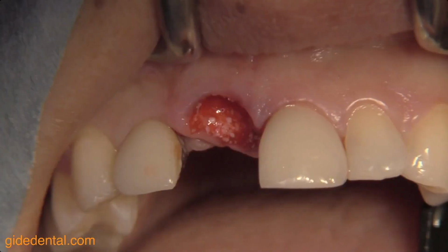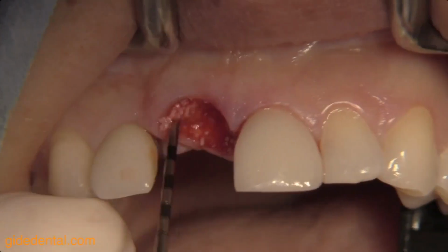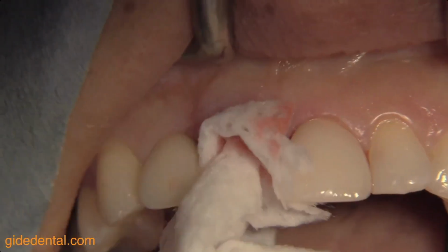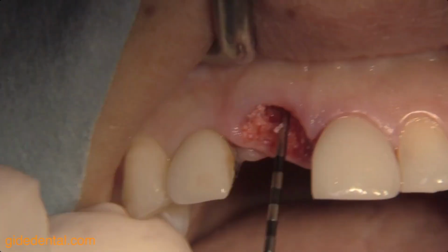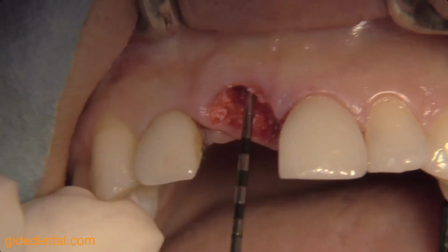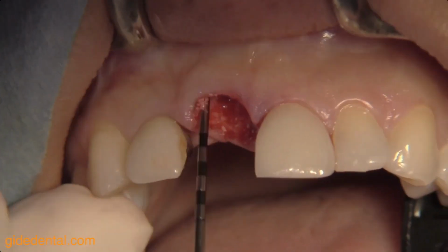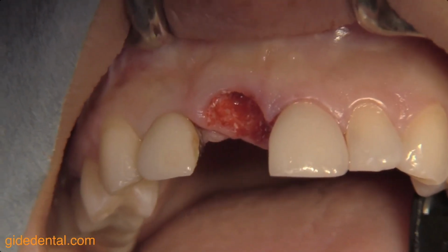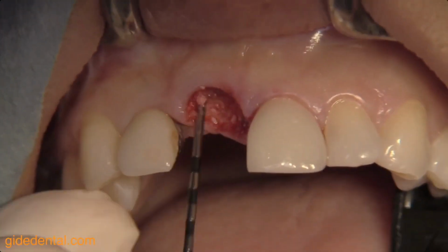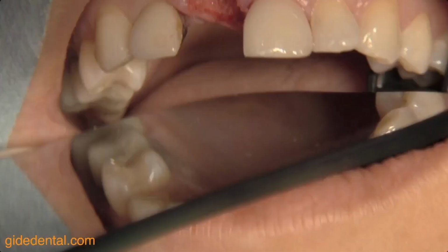So I'm using a small carrier, and I'm using a small condenser. This condenser is about 1 millimeter wide, so really thin. And I can apply that with light pressure onto the biomaterial and really carry it into the depth of the extraction socket. So that's looking really good. You can see that. Nice. You can see the bleeding. I try not to suction this too much. Number one is, of course, you will suction the biomaterial away. And number two is, of course, you also dry it up.